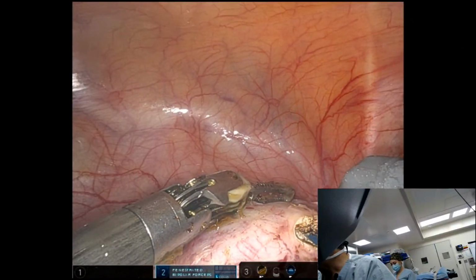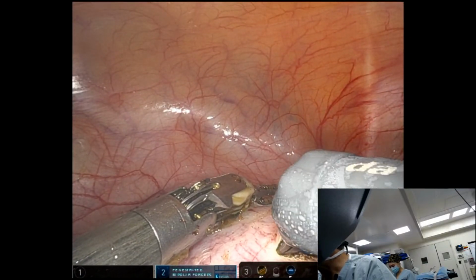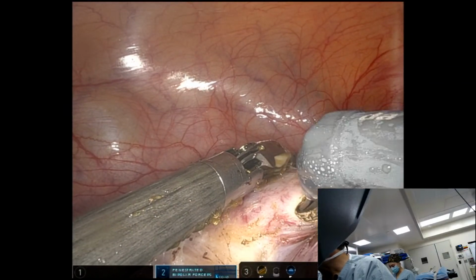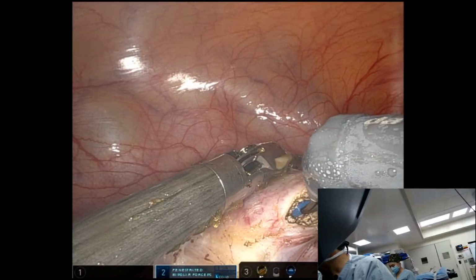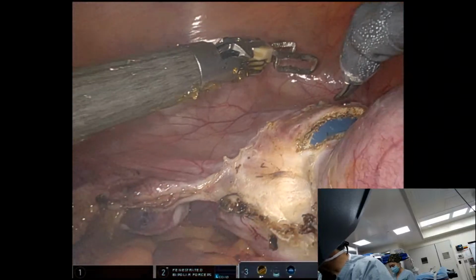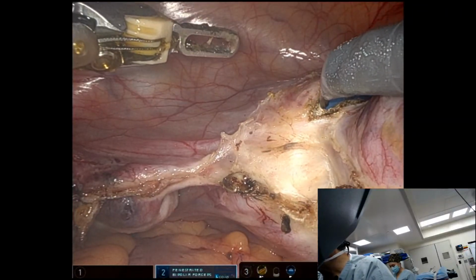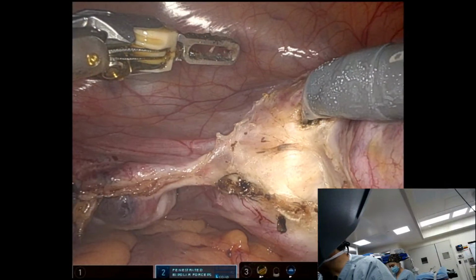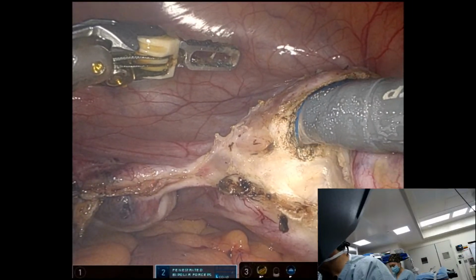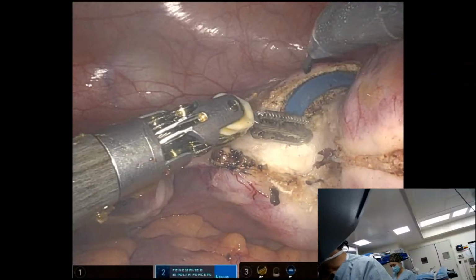If you remember, I put the watts to 5 on the quad, and I go coagulating in this part of the colpotomy. You can go cut, but because we don't have the same hemostasis, we go on coagulation. We have to be sure here that we get the uterine artery.